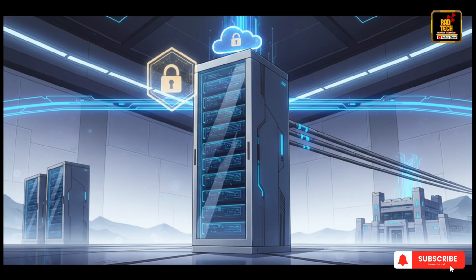We're talking a secure, dedicated network just for these images, really powerful servers that are always on, and this is the big one, regular automatic backups. Losing patient images would be an absolute catastrophe, so nightly copies are sent to off-site or cloud locations. This is the digital insurance policy that protects that priceless library.